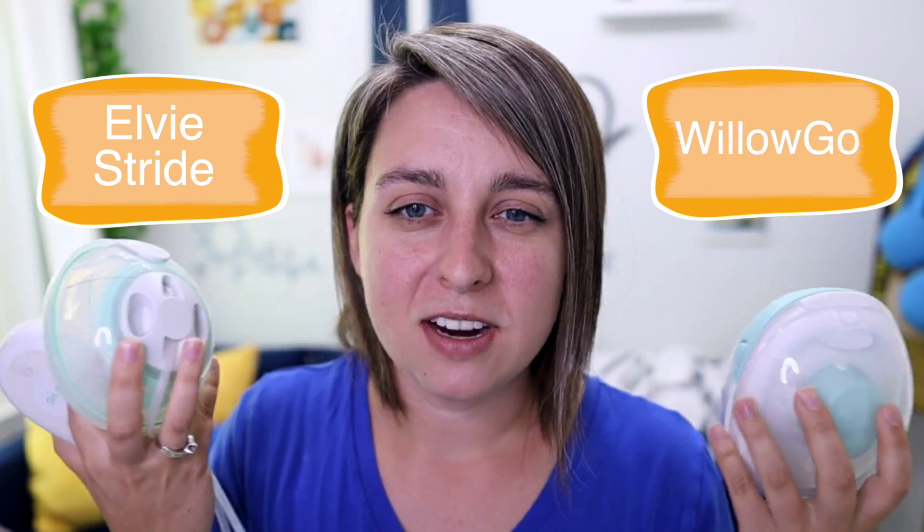Let's start with the LV Stride and the new Willow Go. The LV Stride has been out for a couple months. The Willow Go has been out for a couple of weeks at the time I'm recording this video. So we have a little bit more user information on the LV Stride currently than we do the Willow Go, because the longer they're out, the more reviews we have to really help us compare these pumps.